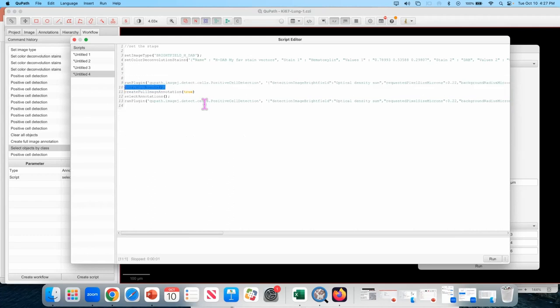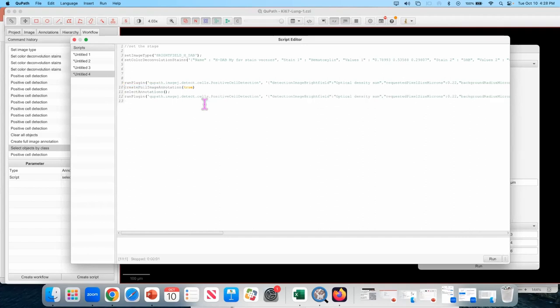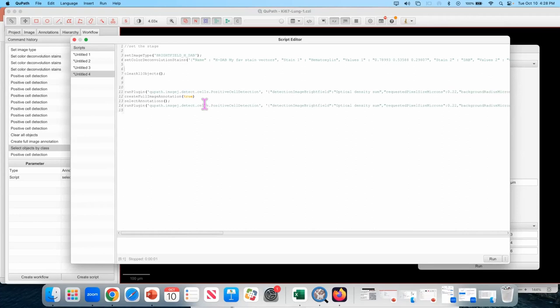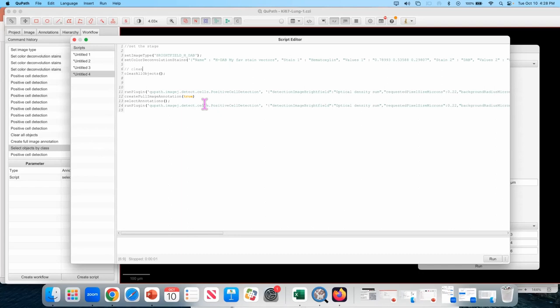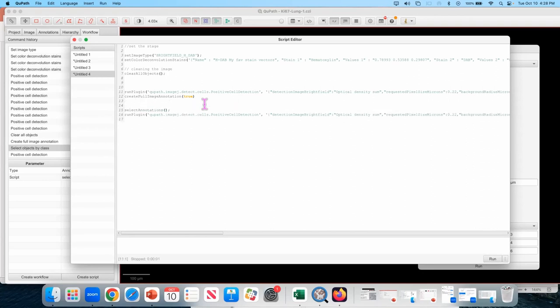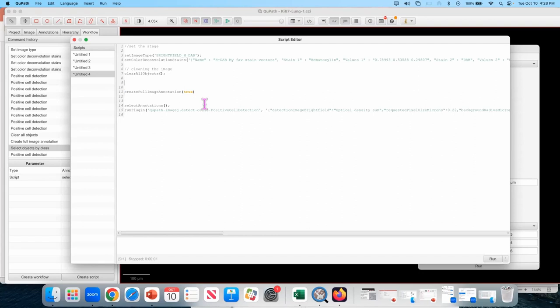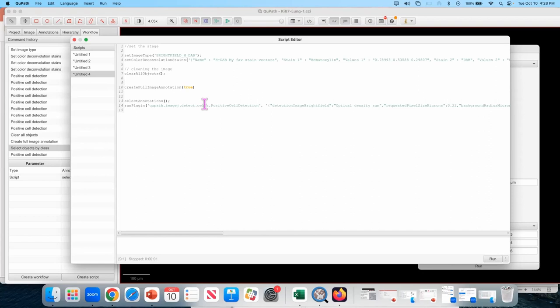Now I told you that there's going to be some housekeeping. That housekeeping or house cleaning is removing all of the objects. This is not strictly necessary, but if you're working on an image where you have some annotations, some objects are already there. For a script to work the best, it's best if you start from a clean system. So this is cleaning image. Now, we need, after that command is done, and this one we also don't need, is to create full image annotation, because QuPath needs an annotation to do a subsequent command.